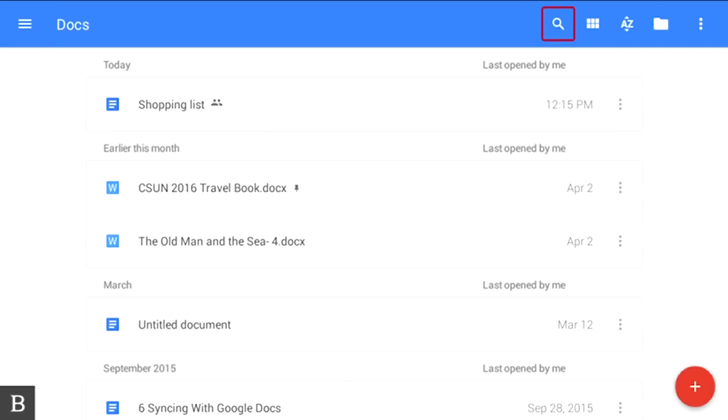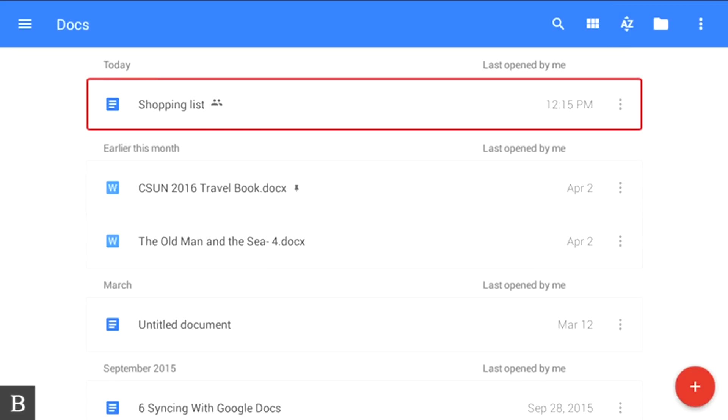I'm going to press S once - Search. S again - Search by. S again - Shopping list Google Docs shared. I had no idea where on this screen the shopping list was. If I was using a touch screen, I would have had to run my finger all over to find it, or swipe right a bunch of times. Here I hit S three times and I'm right there.